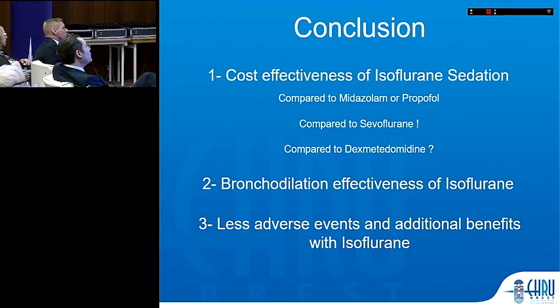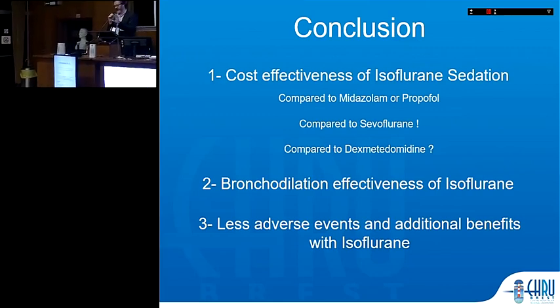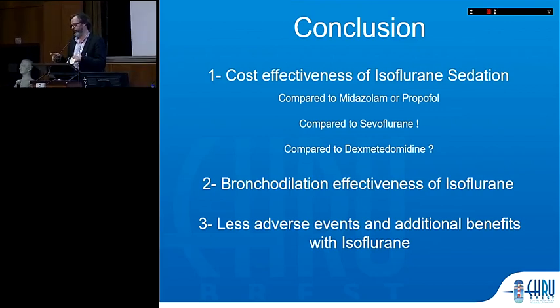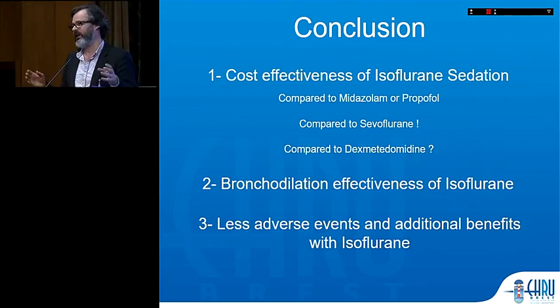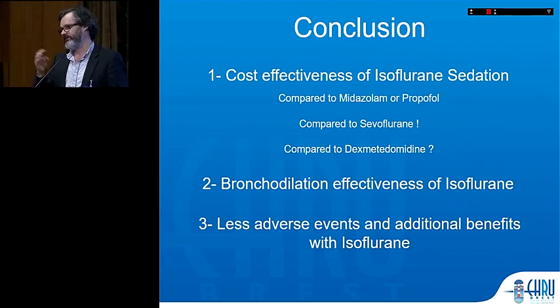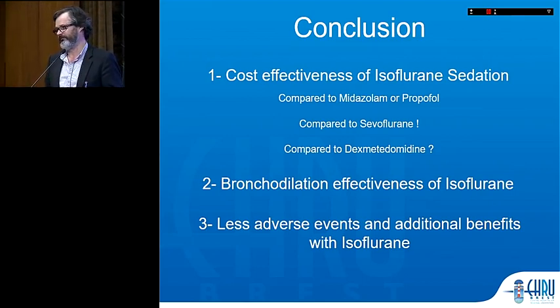No, honestly, for the moment, the pre-hospital care study is just a pilot study. Inside the hospital, we just switch to propofol, honestly just because we don't want to carry the scavenging unit, and the problem is that in the CT scan, nurses will be a little bit afraid of these types of devices, but we could do so.